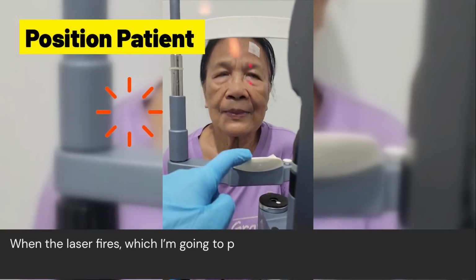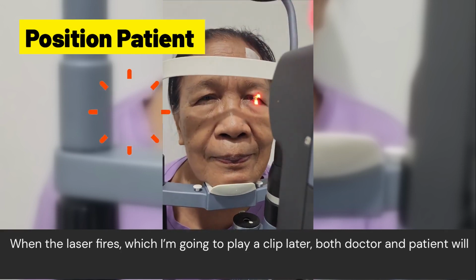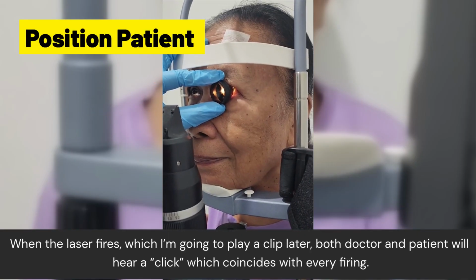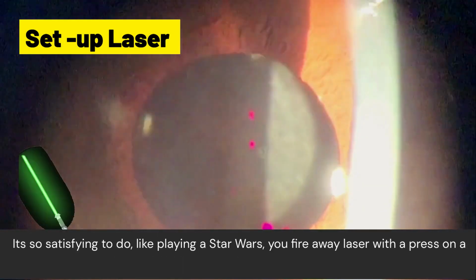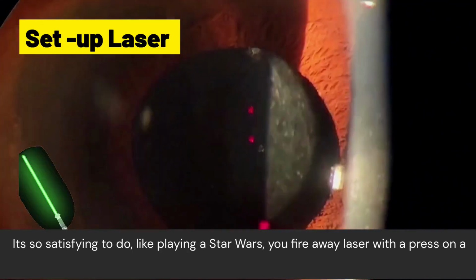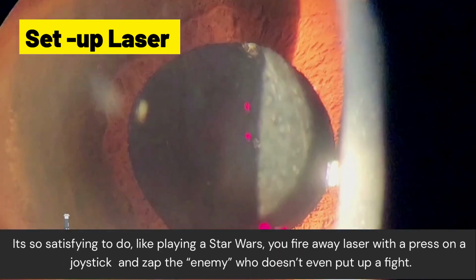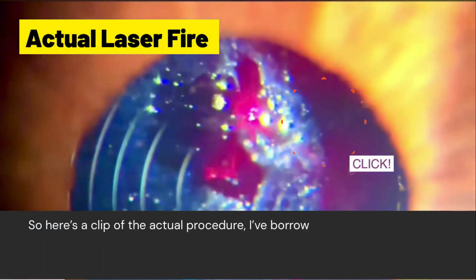When the laser fires, don't worry, I'm going to play a clip later. Both the doctor and the patient will hear a click, which coincides with every firing. Now, this is one of the most satisfying things that I like to do. It's like playing a Star Wars game. You fire away a laser with a press on a joystick and zap the enemy who doesn't even put up a fight. So, here's a clip of the actual procedure.